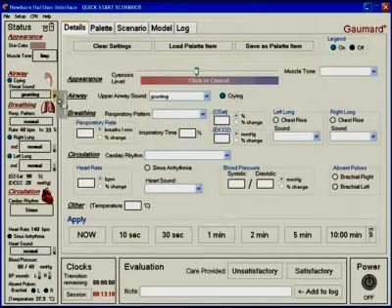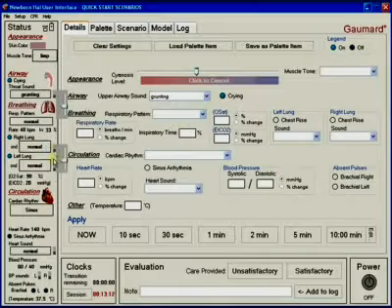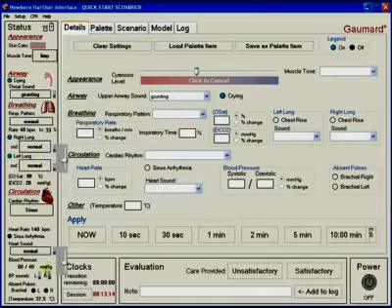From the status viewer, the volume of throat, lung, heart, and Korotkoff sounds can be adjusted.